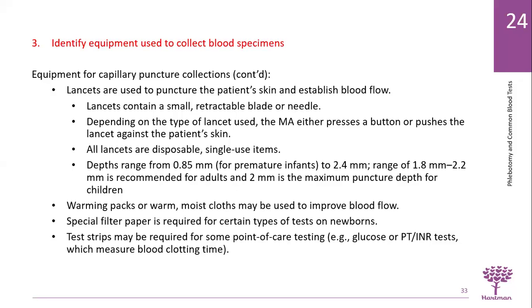Test strips may be required for some point of care testing, such as glucose or your PT, which measures blood clotting. On that special filter paper, that is required for certain types of tests on newborns. Just wanted to go back and emphasize that.